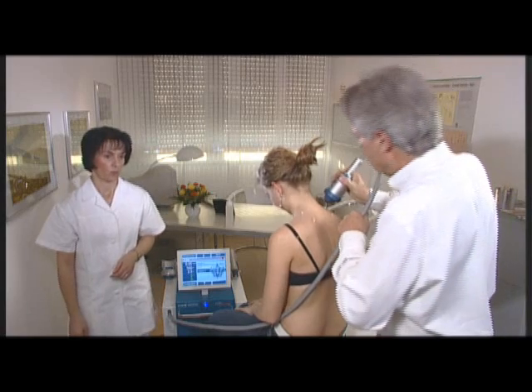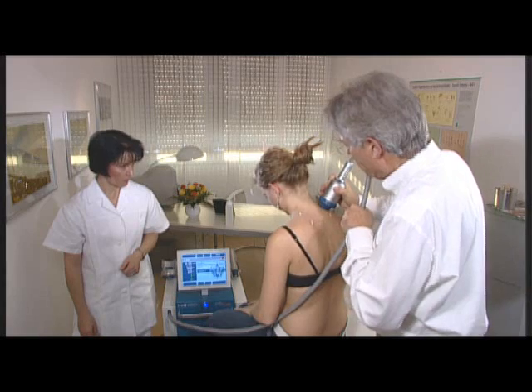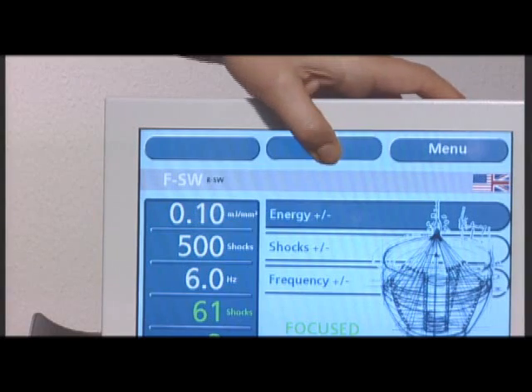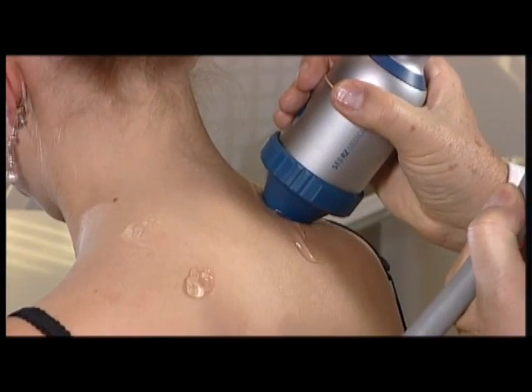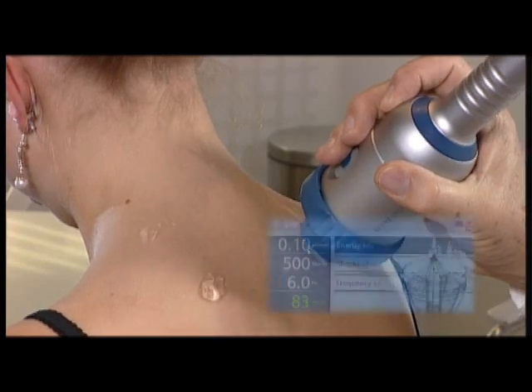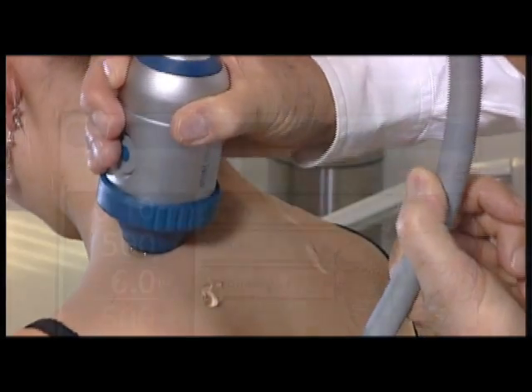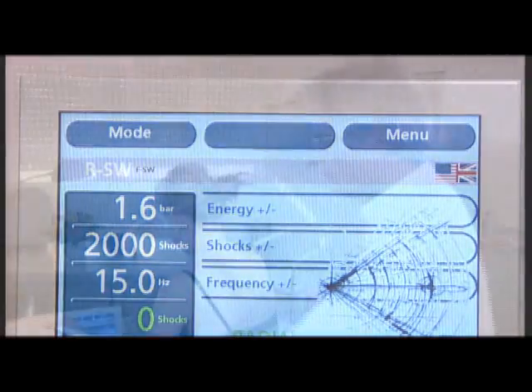Wir suchen jetzt. The diagnosis by palpation reveals extremely hardened muscles at the cervicodorsal junction, in the trapezoid and the interscapular region, and in the shoulder. The painful trigger points are palpated actively on the basis of the patient's feedback. Precise localization is then performed by means of focused shock waves. Radial pressure wave therapy is conducted according to the principles of low-energy trigger point treatment, using 2000 pulses per session.